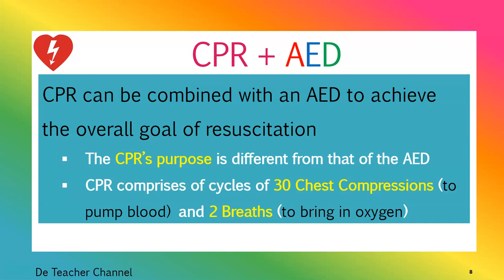But remember that AED detects abnormal heart rhythm. CPR doesn't do that. AED is able to eliminate abnormal heart rhythm. CPR is not able to do that. But AED cannot pump blood, and AED cannot bring in oxygen.